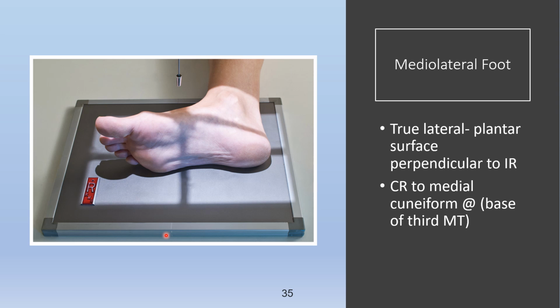You're still collimated. The book seems to tell you 8 by 10, but I would tell you 10 by 12. And it's portrait to the long axis of the IR. All right, even when they show you in the book, they reference it as portrait, but they're looking at the long axis of this. So to us, it would probably look landscape. All right, 65 at 1.2. Patient is going to roll the affected leg outward, flex their knee, and roll it about 45 degrees.